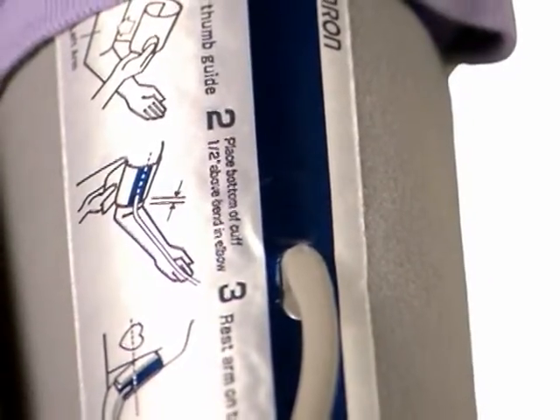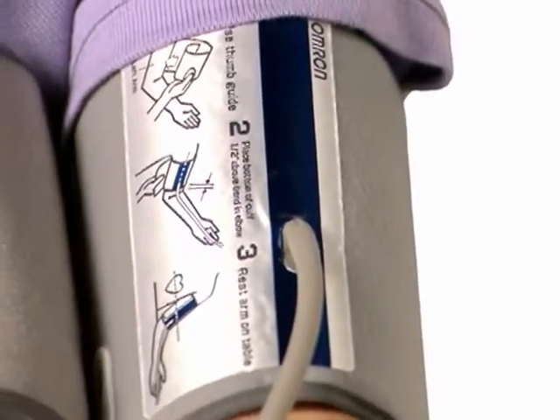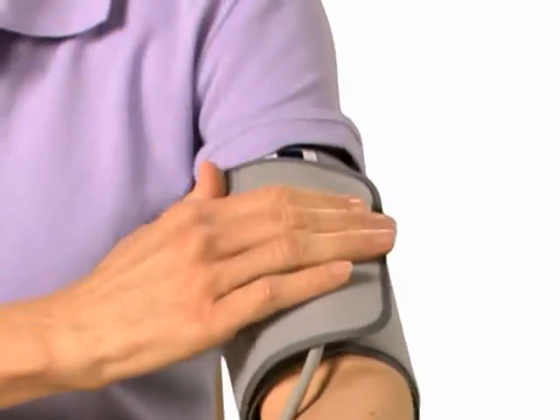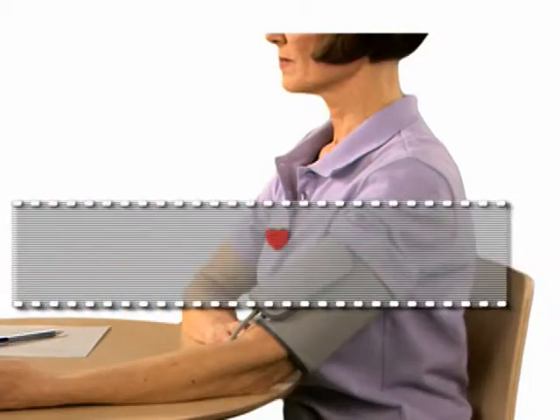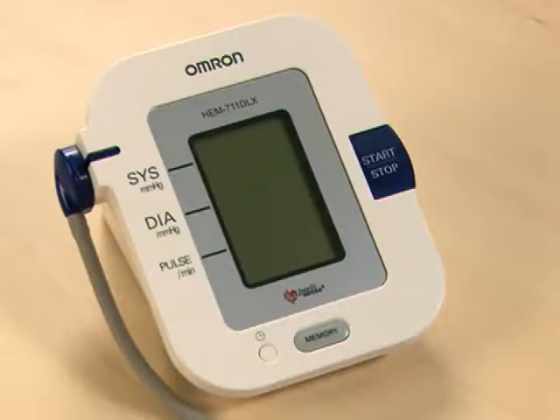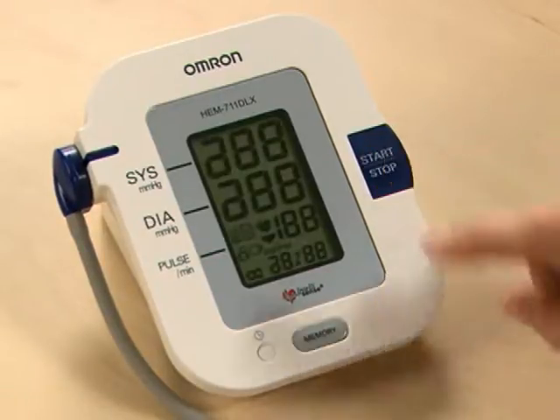Make sure the blue stripe is centered on the inside of your arm, with the tubing pointing down towards your hand. Close the cuff snugly. Place your elbow on a table so the cuff is level with your heart and your left palm up. To turn the unit on and take a measurement, press the start-stop button once.